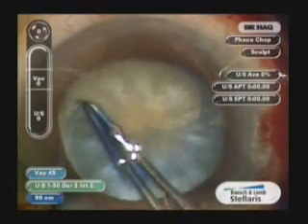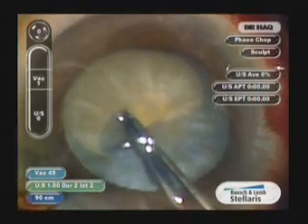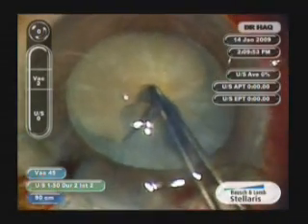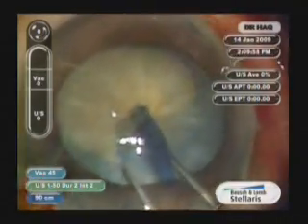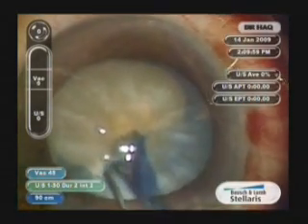Now some reverse tear and the line of the rhexis is back where we want it, and we will continue to tear. Always grab close to the tear juncture to have more control.